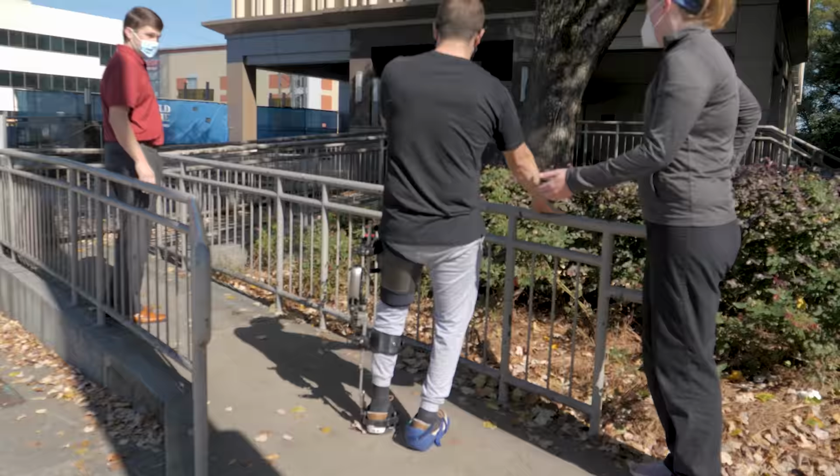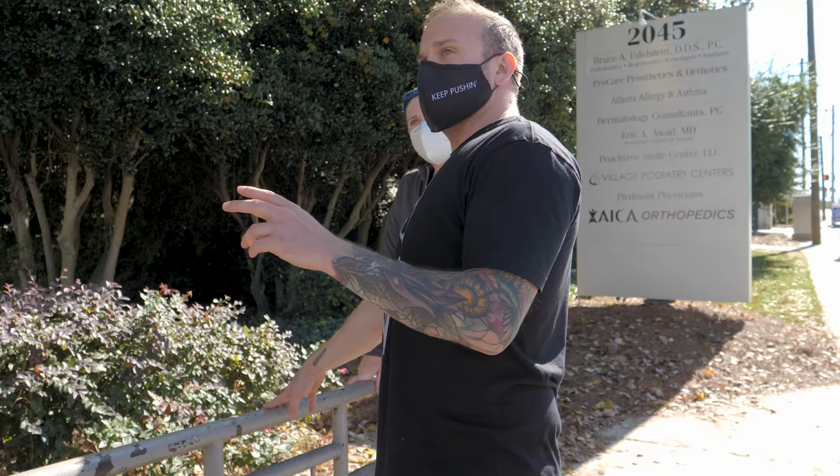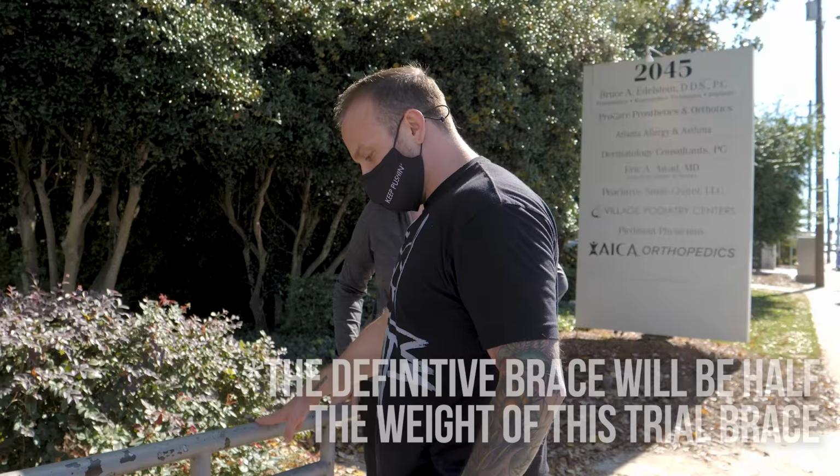Going down, I wasn't a huge fan. That's where the setting for going down, like the sitting, comes into play. It's just really, really high. It felt good with sitting, but it's too much when you feel like you're going down the slope. That could be a factor, or just that this weighs so much. I'm having a hard time lifting it up.